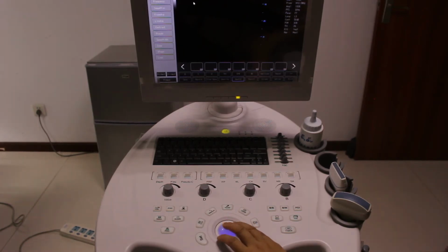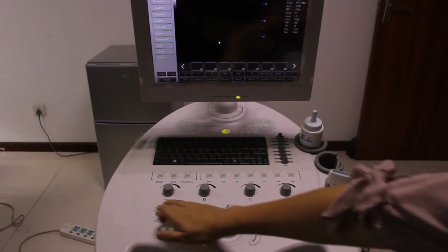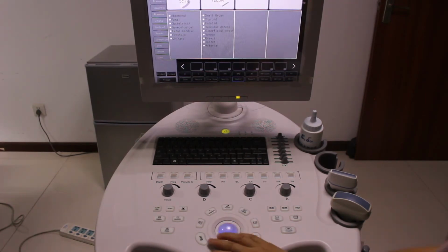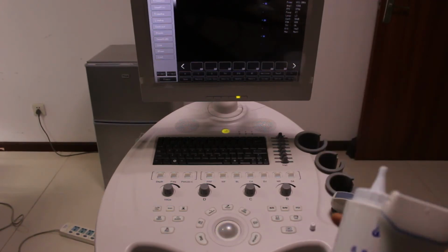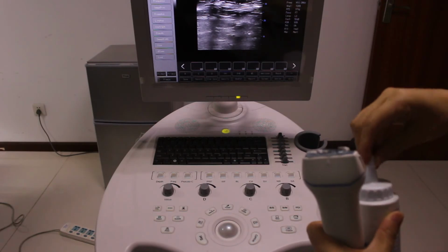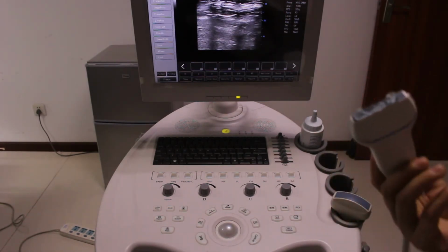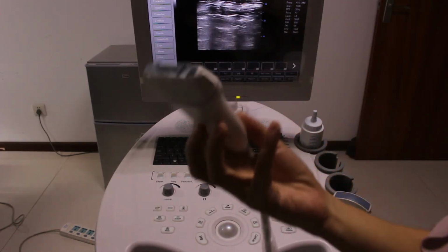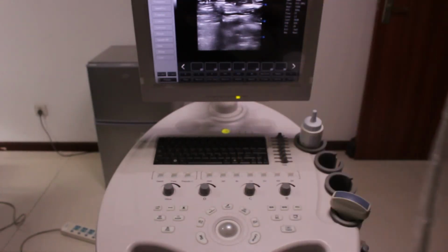So now we enter into the scanning mode of this patient, that female 54. Of course we have to choose the probes to get the carotid, and then use this linear probe and add in some gel. I guess doctors will know where the carotid is. They need to feel the carotid at first and then put the linear probe surfaces in this way. When it is in this way, then you can get the images like this one.